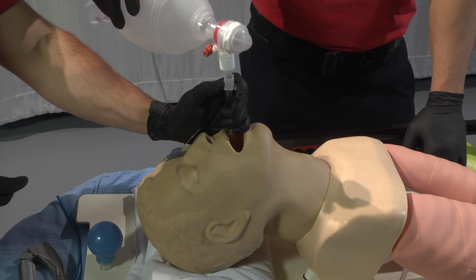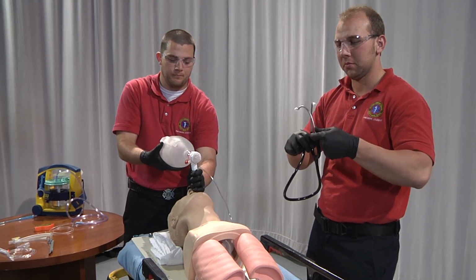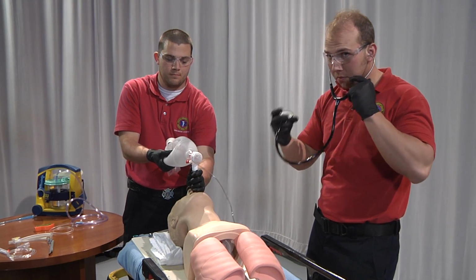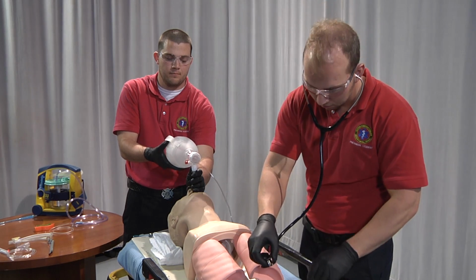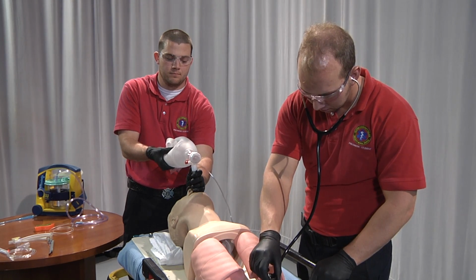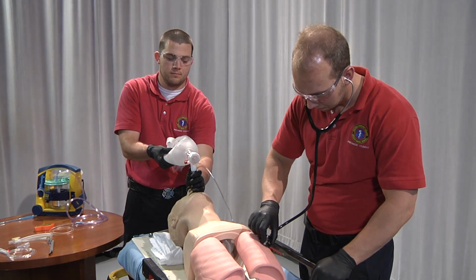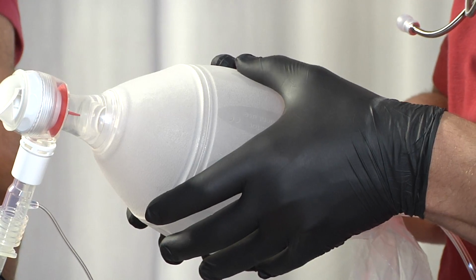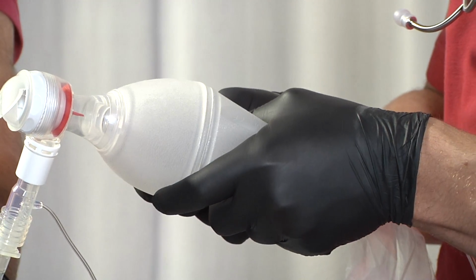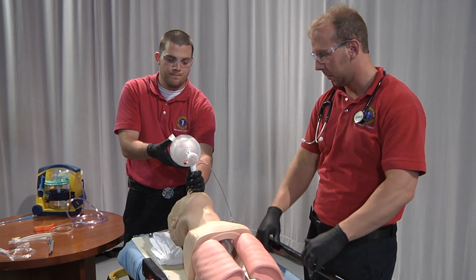Begin ventilating the patient through the endotracheal tube and begin confirmation. Initially, confirmation should be done by visualization of the tube through the cords and auscultation over epigastrium and bilaterally over the lung fields. Remember to maintain a continuous hold of the tube until the proper securing technique has been achieved. Continue verification through multiple measures.